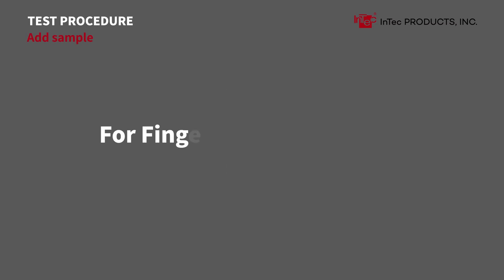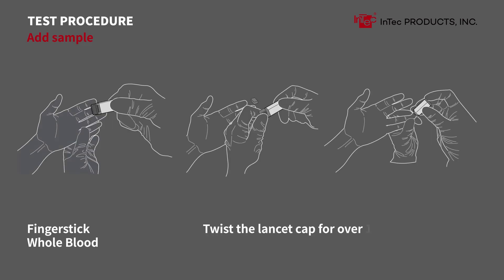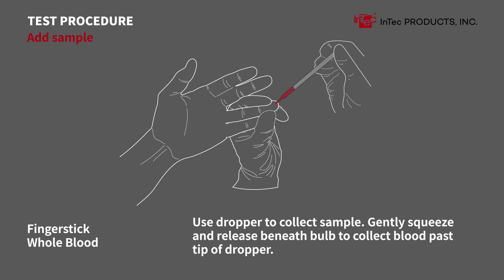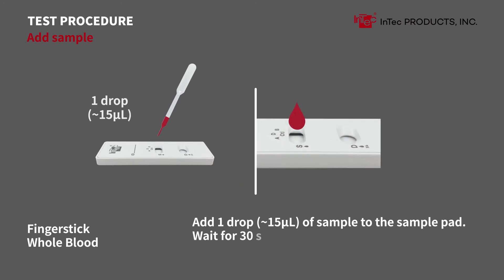Adding sample — finger stick whole blood. Clean the finger with an alcohol swab and leave it to dry. Twist the lancet cap over 180 degrees and remove it. Place the lancet firmly on the side of the finger to trigger it. Gently massage around the bleeding point. Use the dropper to collect the sample by gently squeezing and releasing beneath the bulb. Add one drop of sample to the sample pad. Wait 30 seconds, no more than 3 minutes.